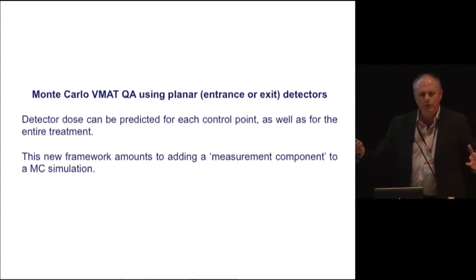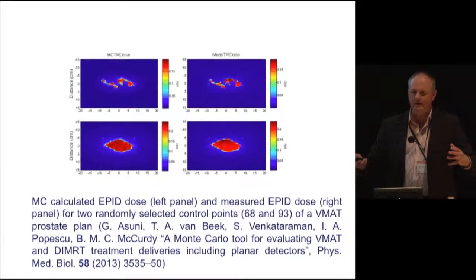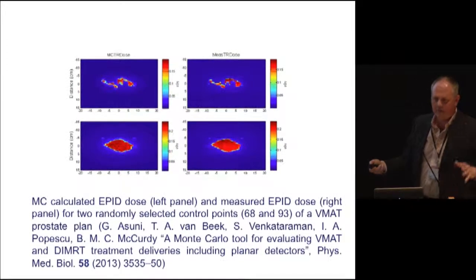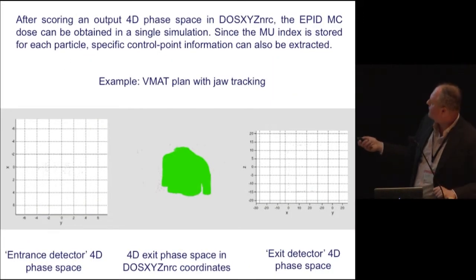And you know, you can do pre-treatment QA as much as you want, but then if you do a wrong move, or think about something like the New York incident, something that happens down in the 5th fraction. So obviously, we need to do more than just pre-treatment QA on a phantom. We need to see what happens with the patient there.